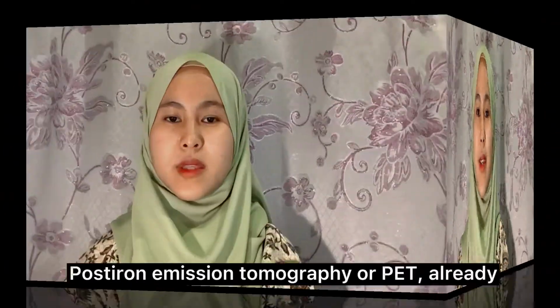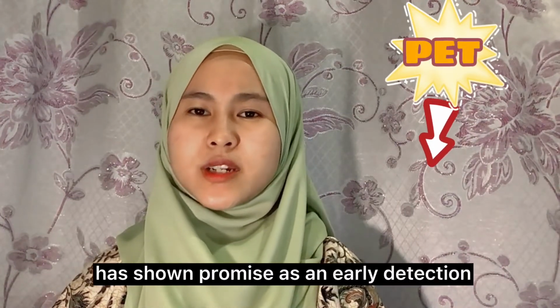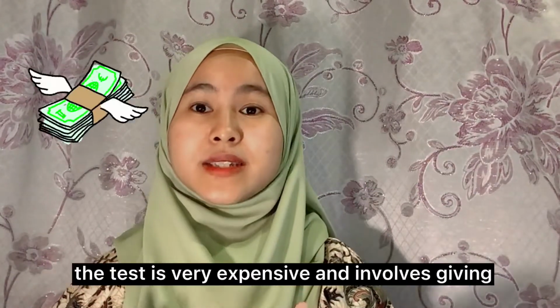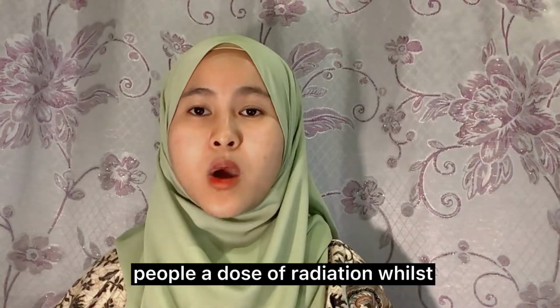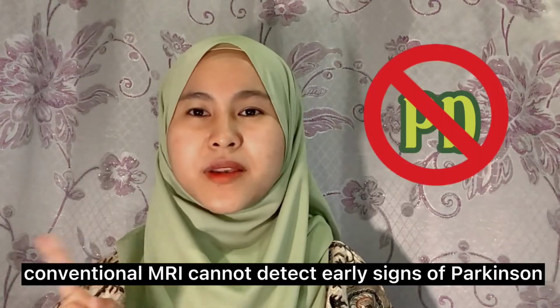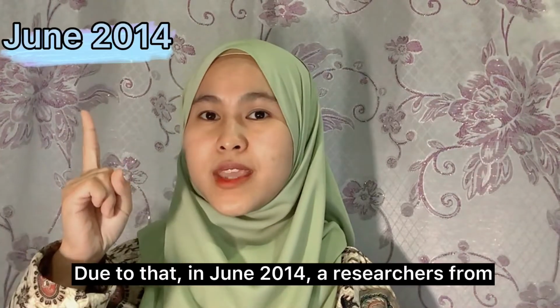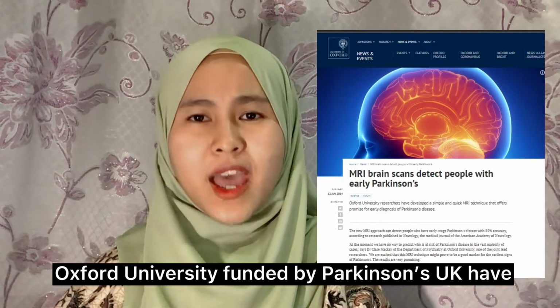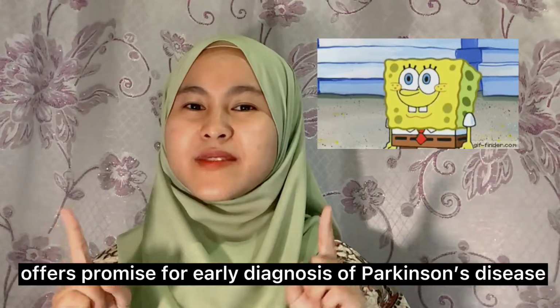and treatment monitoring. Positron emission tomography, or PET, already has shown a promise as an early detection tool for Parkinson. However, the test is very expensive and involves giving people a dose of radiation, whilst conventional MRI cannot detect early signs of Parkinson. Due to that, in June of 2014, researchers from Oxford University, funded by Parkinson's UK, have developed a simple and quick MRI technique that offers promise for early diagnosis of Parkinson disease.